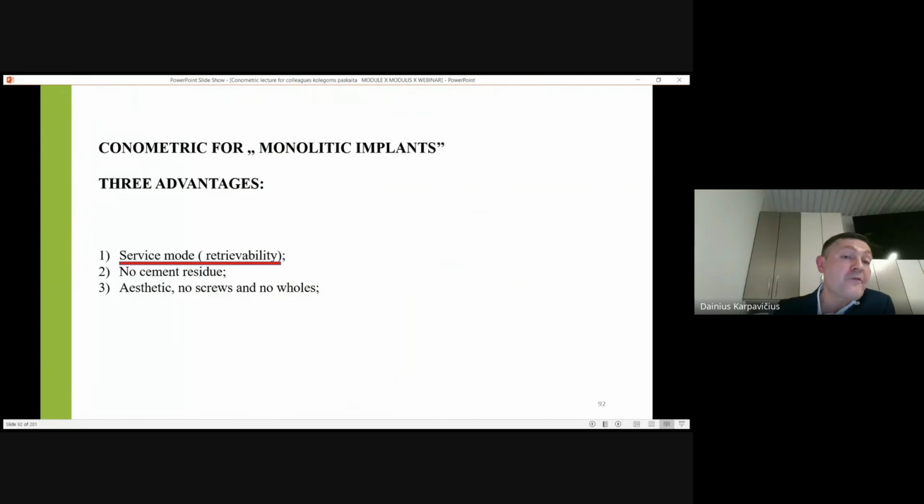And here also we found some advantages while using this type of prosthetic solution for monolithic. This is one of the very sensitive ones: retrievability, to remove the prosthetic whenever it is necessary. Even after 10 or 15 years, if it is necessary to cut everything in the mouth, it's a nightmare. We passed all this. Our department is more than 40 years old.